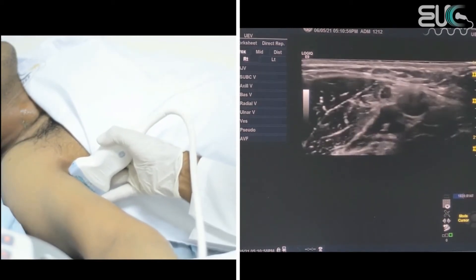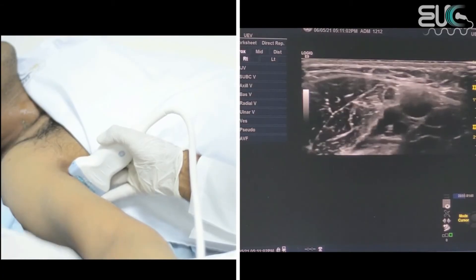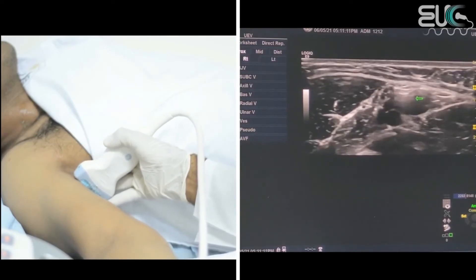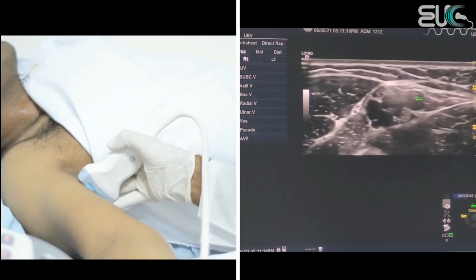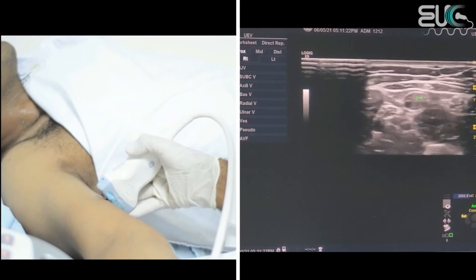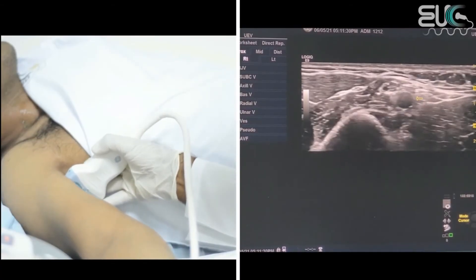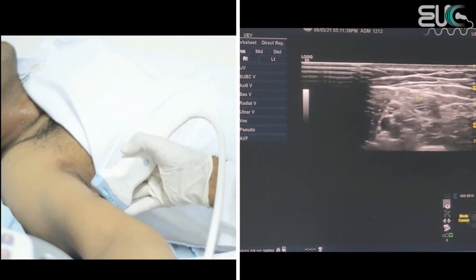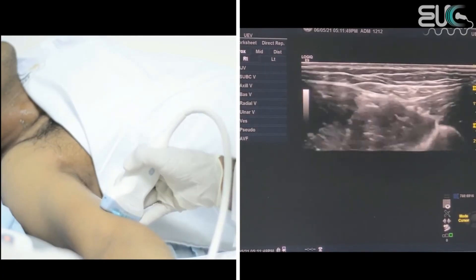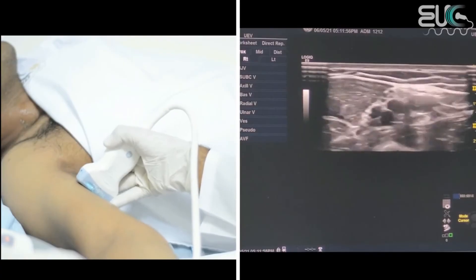In the upper arm, you have to define the brachial vein, which is the deep venous system near the brachial artery, while the basilic vein will be superficial and away from the artery. As you can see, we have a vessel that divides into two, and one starts to move away and become superficial from the brachial artery — this tends to be the basilic vein. I will check compressibility over the basilic vein at the upper arm, mid arm, and lower arm — and it is totally compressible at each level. After checking compressibility, you also have to take it in the sagittal plane and apply color and pulse wave.